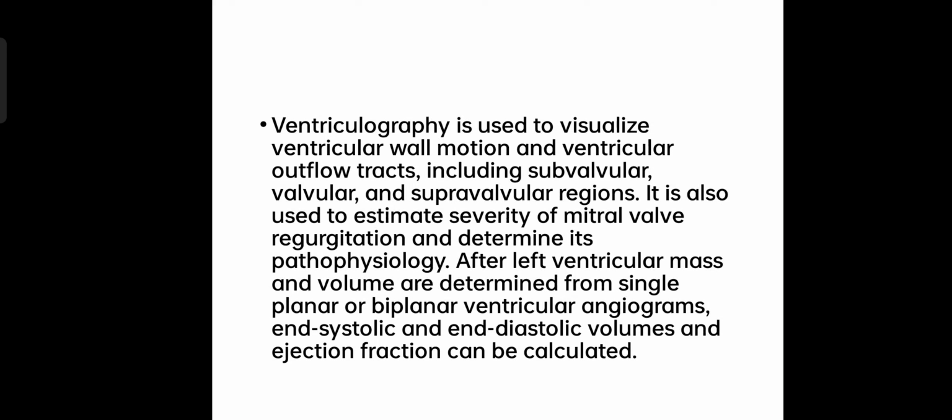Ventriculography is used to visualize the ventricular wall motion and ventricular outflow tract, including subvalvular, valvular, and supravalvular regions. It is also used to estimate the severity of mitral valve regurgitation and determine its pathophysiology. After left ventricular mass and volume are determined from single planar or biplanar ventricular angiograms, end systolic and end diastolic volumes and ejection fraction can be calculated.